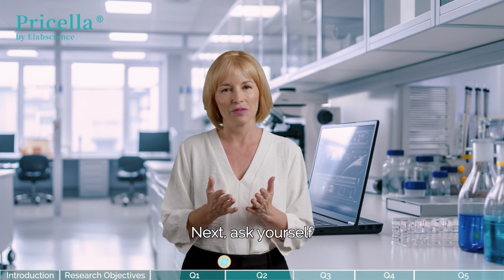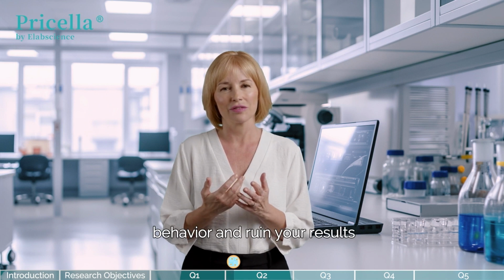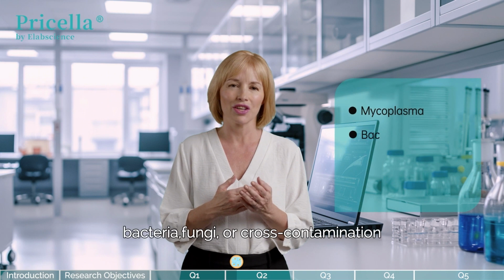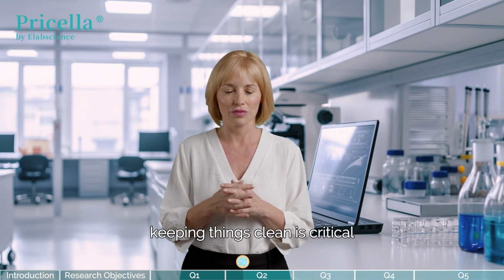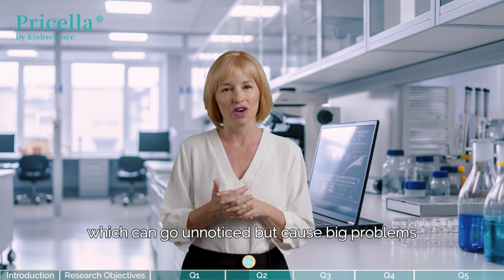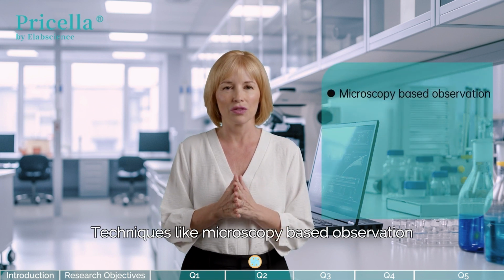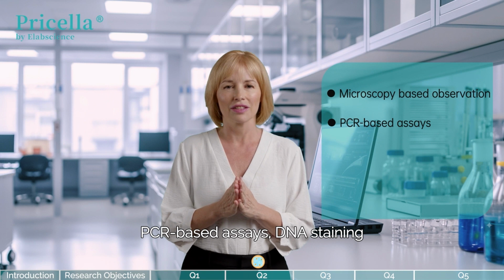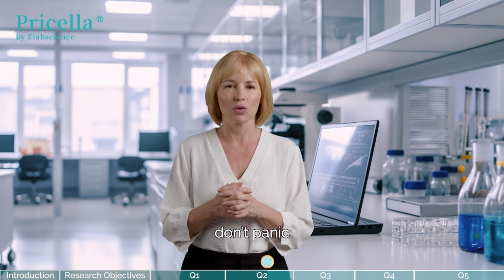Next, ask yourself, is it free of contamination? Contamination can quietly alter cell behavior and ruin your results. Whether it's mycoplasma, bacteria, fungi, or cross-contamination, keeping things clean is critical. Regular screening is a must, especially for mycoplasma, which can go unnoticed but cause big problems. Techniques like microscopy-based observation, PCR-based assays, DNA staining, or enzyme-based methods can help identify contamination. If you find mycoplasma, don't panic.